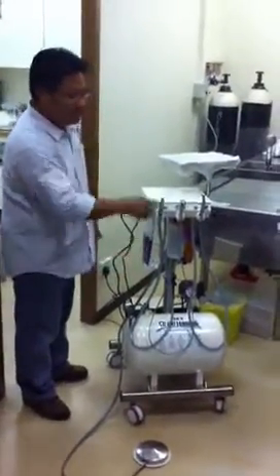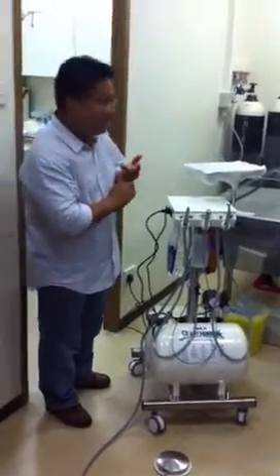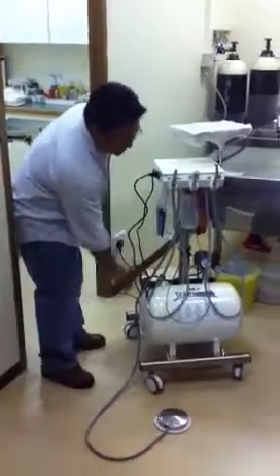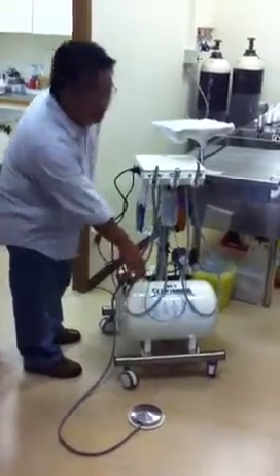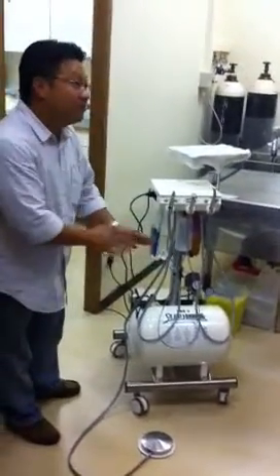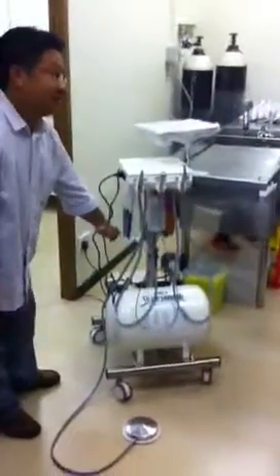pressure to drive the high speed hand piece, as well as the low speed hand piece. Okay, just to orientate you around. This is the compressor. This is the air tank, right? iM3 uses an air tank to stabilize pressure. Most others would use direct feed of pressure.